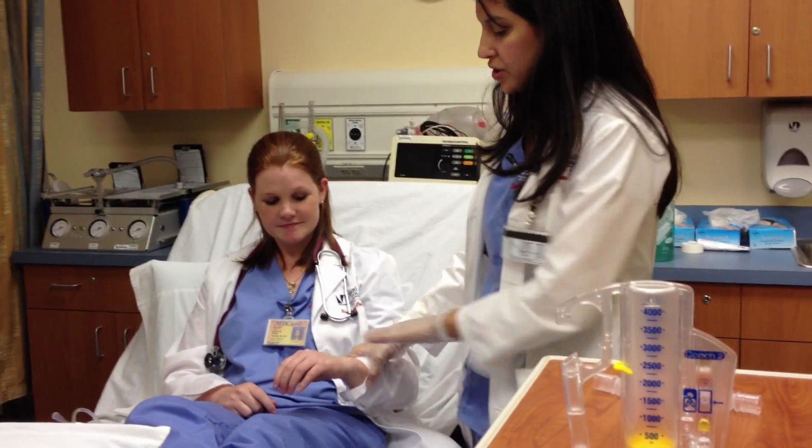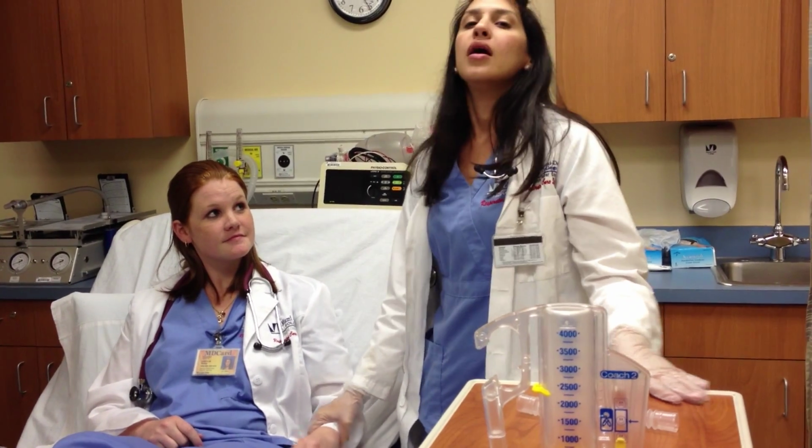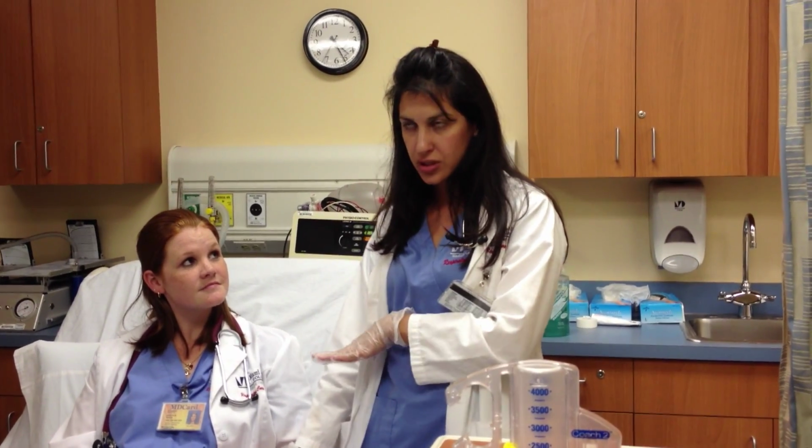After you put on your gloves, you identify your patient. I checked that my patient is Krista Wilson and her date of birth with the chart. Before you go on explaining to your patient what incentive spirometry is, you need to make sure that you do a baseline assessment. This includes setting a target volume, a goal for your patient, pre-vital signs, and pre-breath sounds.